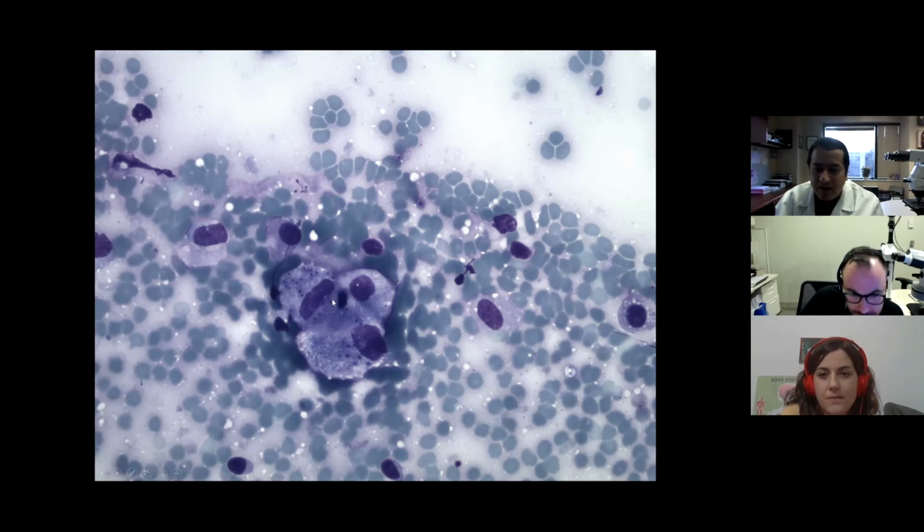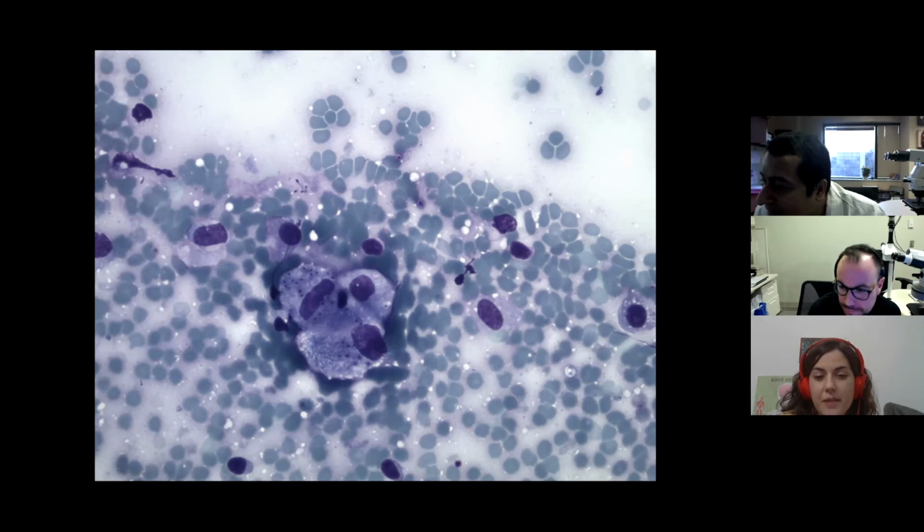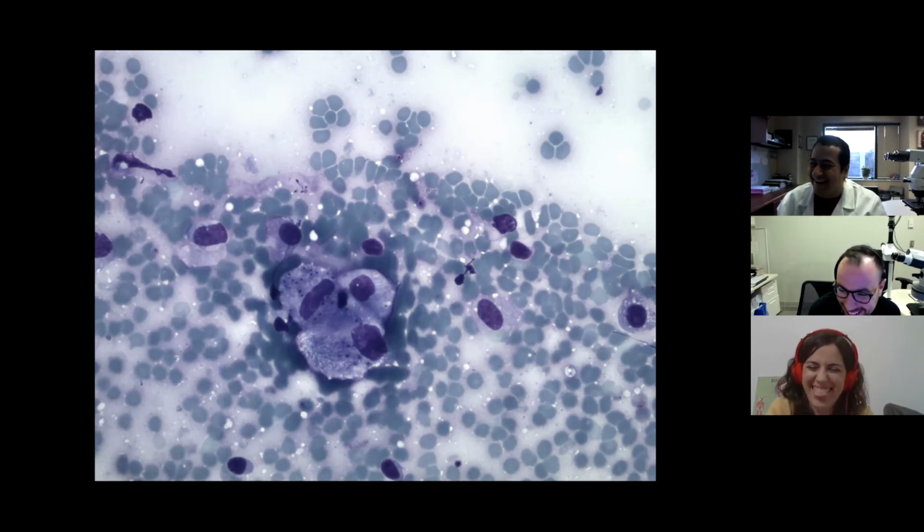Is the histo. Right? So if I give you a different stem, let's say I told you this is an Indian patient and these are lesions in the spleen, you should be thinking disseminated leishmaniasis, right? But in the stem I gave you, this is virtually always disseminated histo. And of course, the one stain you want to confirm it is a GMS. Once you get the GMS stain, this is basically diagnostic. Yeah, if it's an Indian patient who is visiting the river... Yeah. This is an Indian patient who lives in Columbus. The pixel is wider.